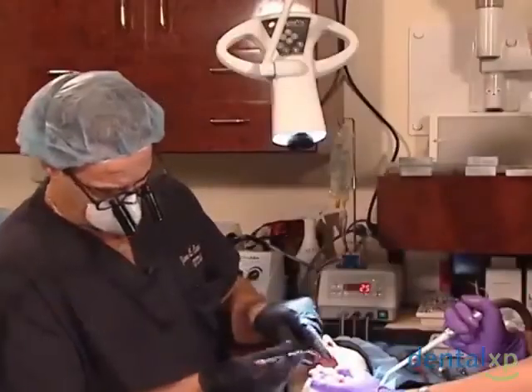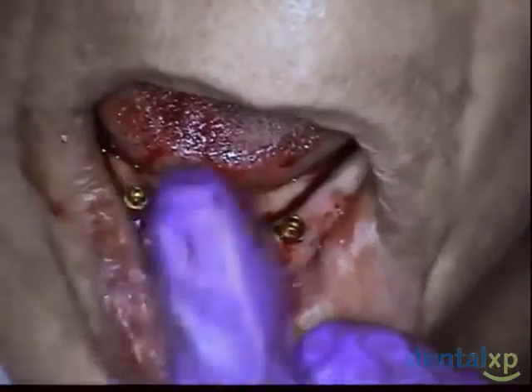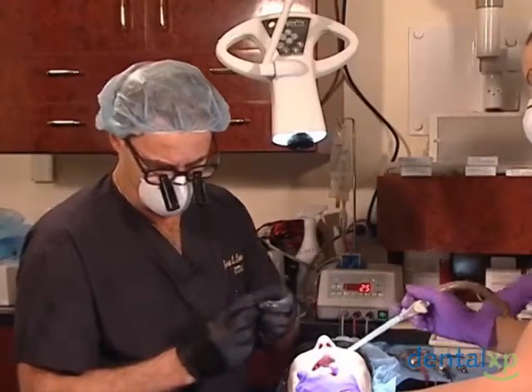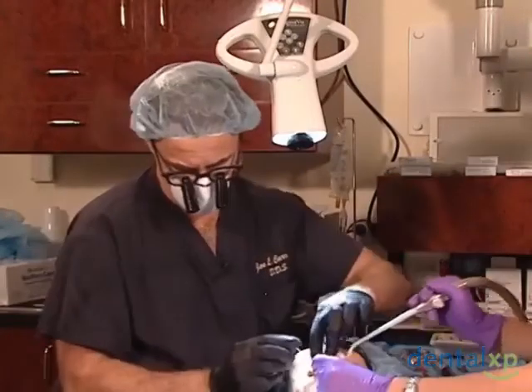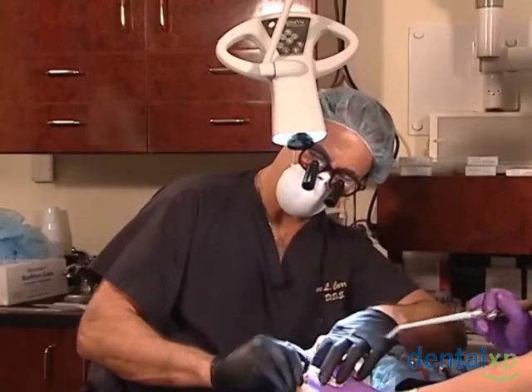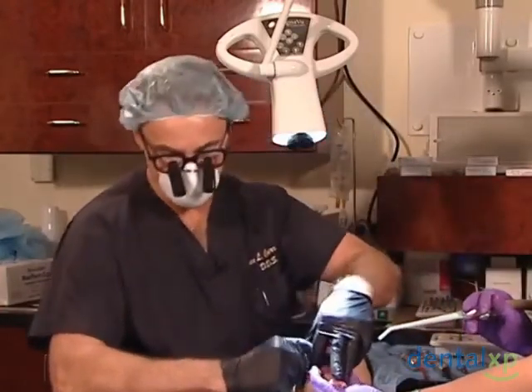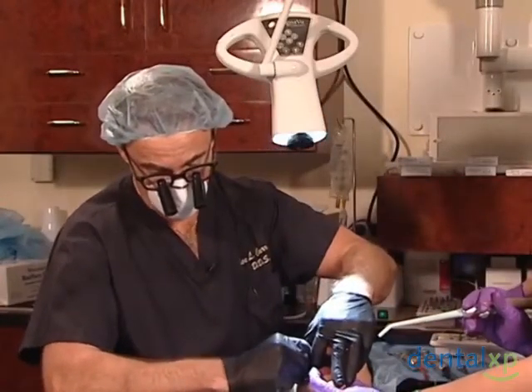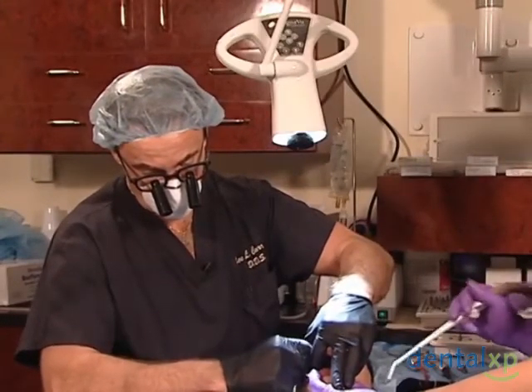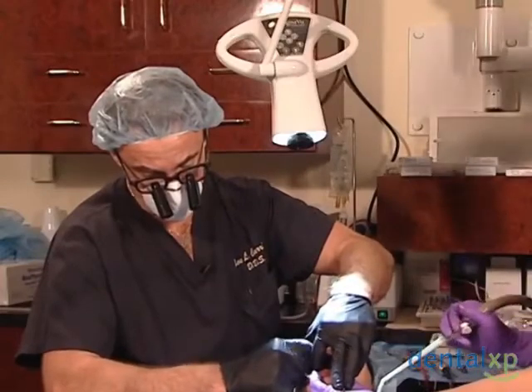As you remove your driver here, you don't want to rock it back and forth, especially unless you've stabilized it, because that is a very small implant. It's extremely critical if you diagnose that you're going to be in thin bone, that when you place these, you make sure that you're not creating a new osteotomy site, or worse, fracturing that buccal plate of bone, which you've so desperately tried to maintain.